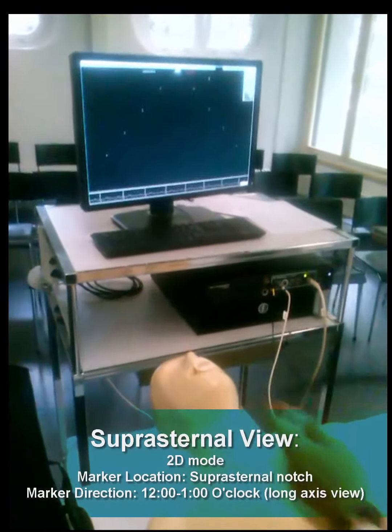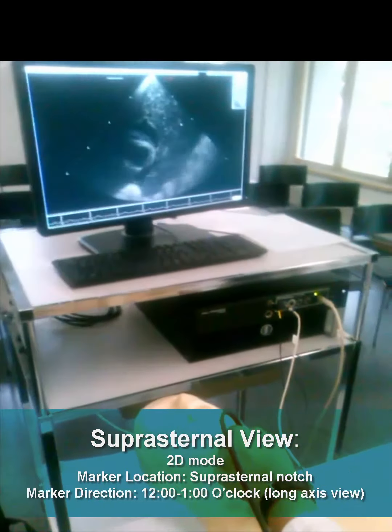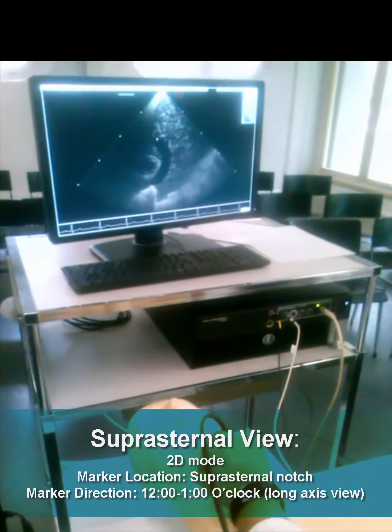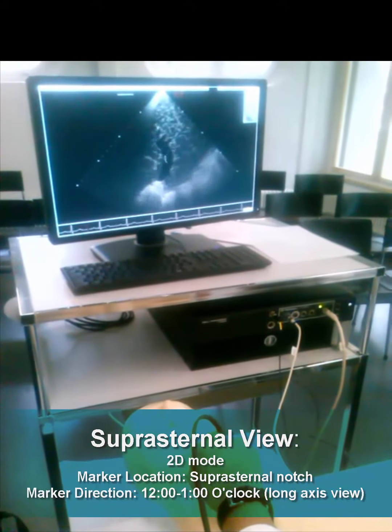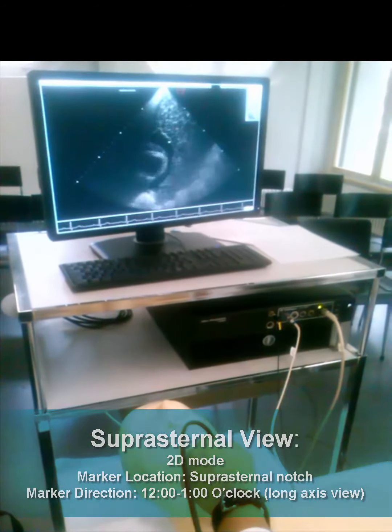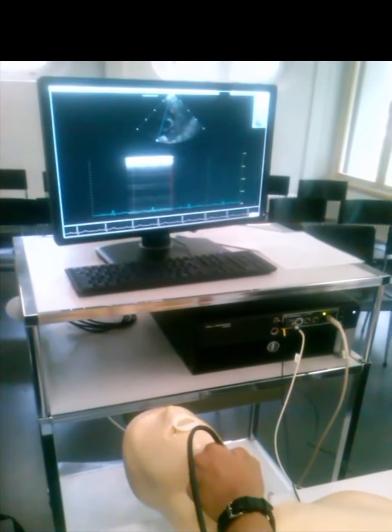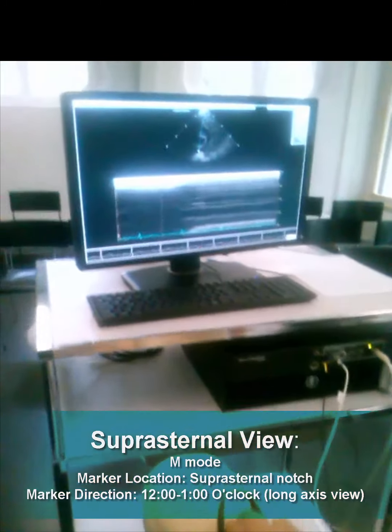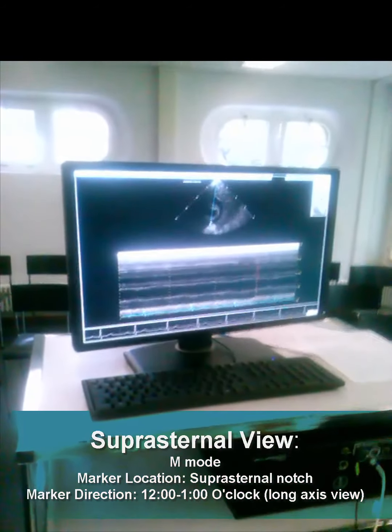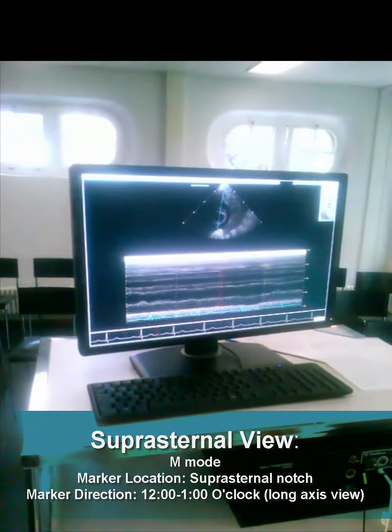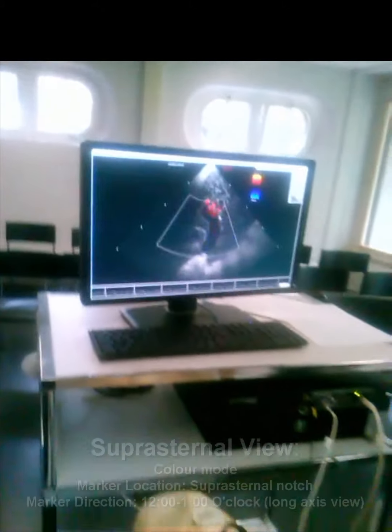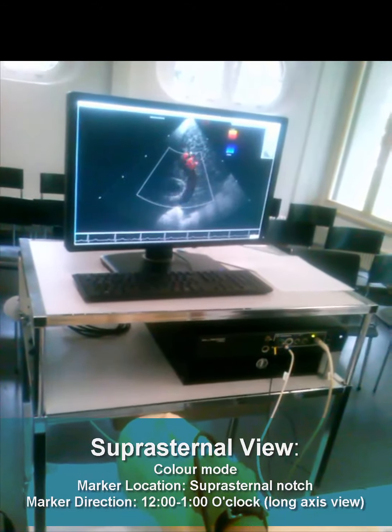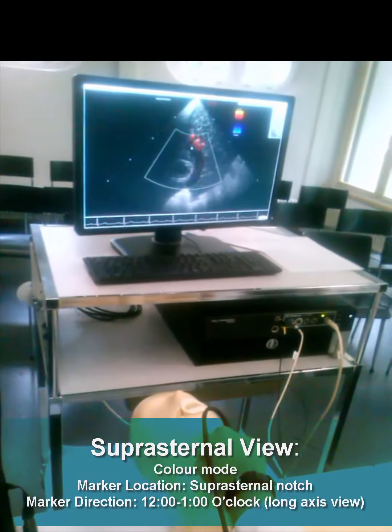Now we will show the suprasternal view. As you can see, three parts of the aorta are shown: ascending, arch, and descending. Now we will go to M-mode where we can see the diameter of the aorta — we can measure the ascending part. Now we have the color Doppler. You can see the red waves — they are going toward the probe — and the blue waves, they are going in the other direction away from the probe.